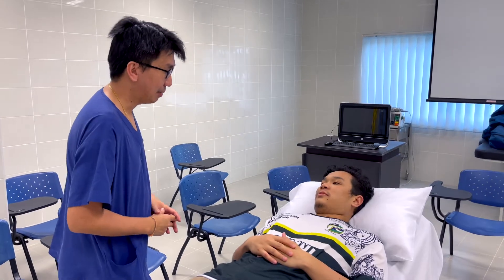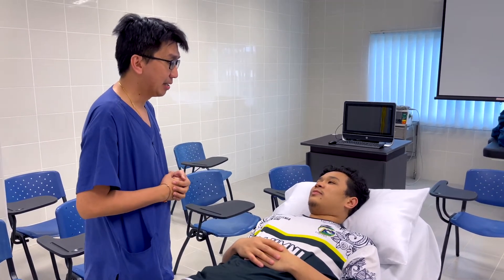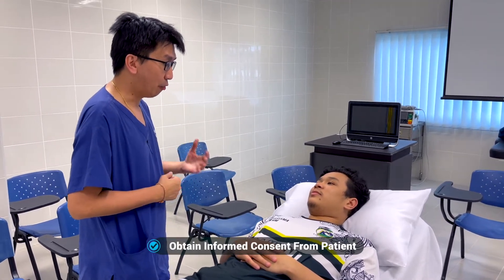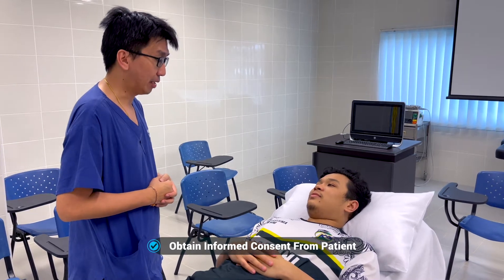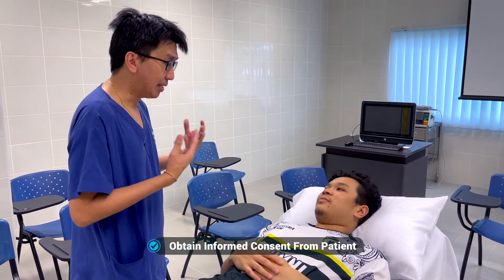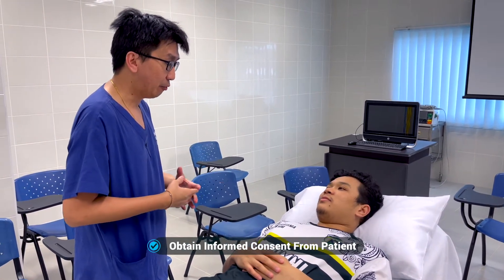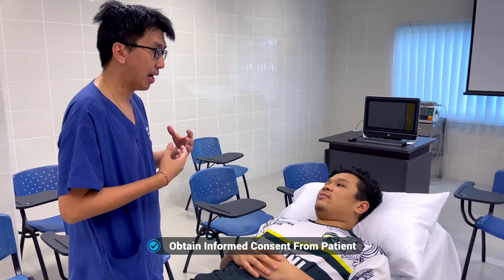Good afternoon sir. I'm Dr. Yap, I'm an anesthetist. I would like to perform a lumbar puncture on you. Is that okay? Yes. Alright, let me tell you briefly about the procedure.